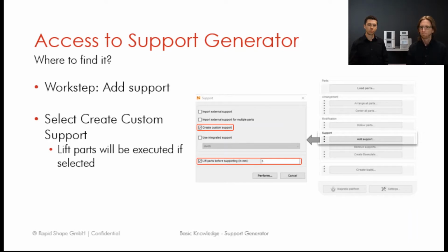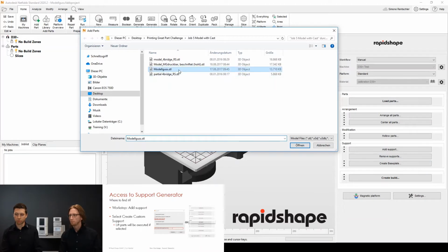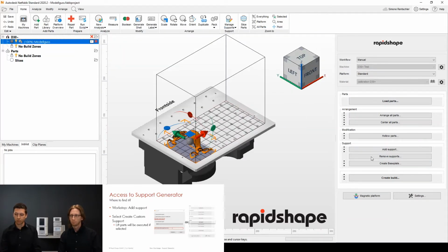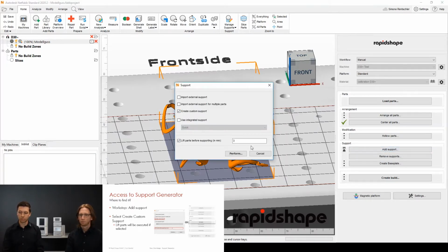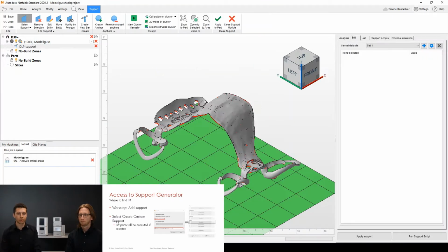All right. So we will quickly, I think, just show it also live. Yes. So we will just load a part. In this case, we will just load the one which we have seen in the picture before, so the partial framework. We will center it, and now we're going to have a look at how to support it manually. So I will click on Add Support, as Robert said, create custom, and lift is already active, and perform this.